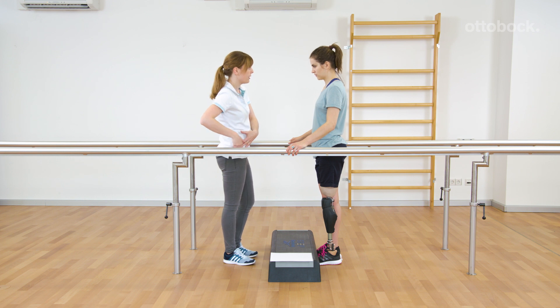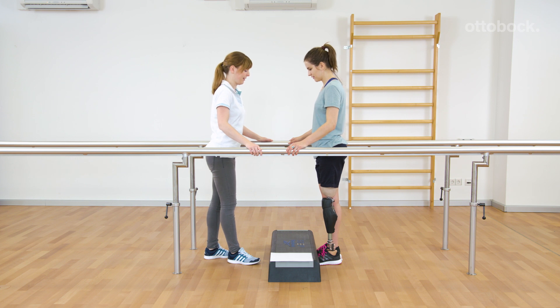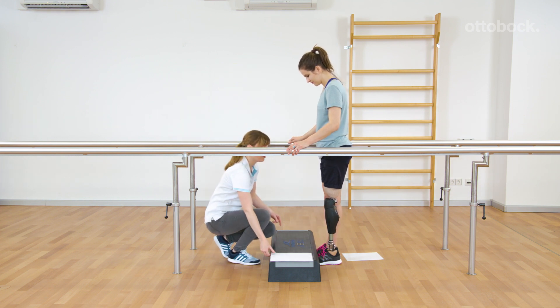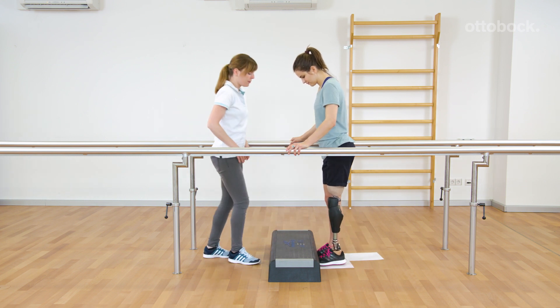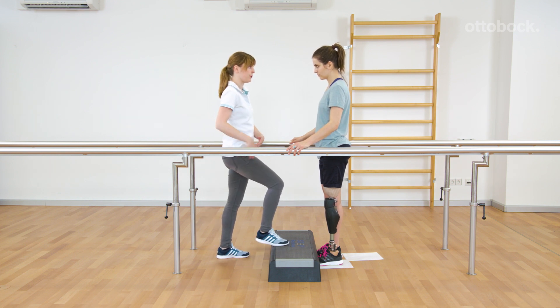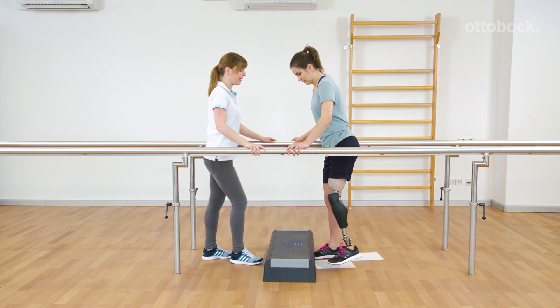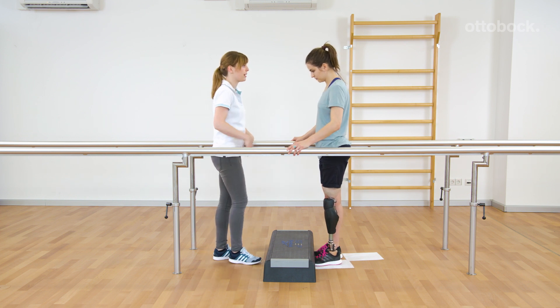The movement occurs first backwards with weight on the leg and contact with the floor, then forward and up in the hip flexion direction. To trigger the stairs function, the prosthesis has to be loaded first. If the user is having difficulties at the step, the pattern can be trained without a step first.